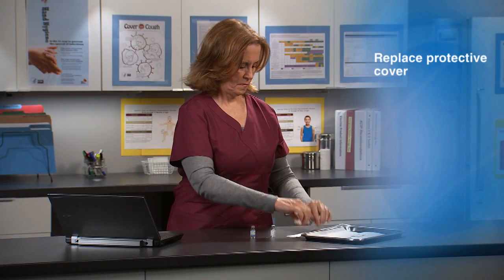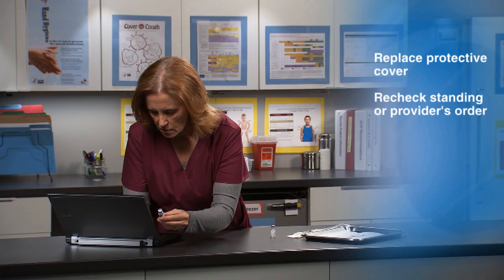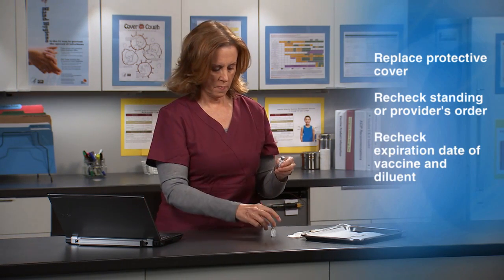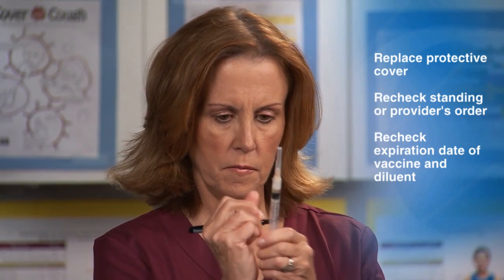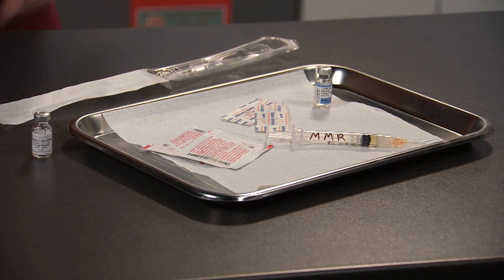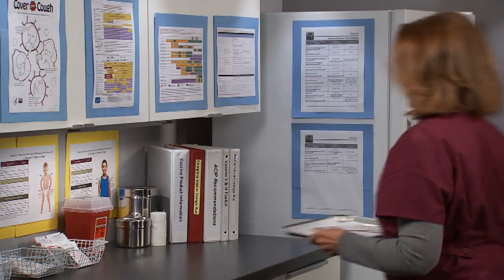Now carefully recap the needle by replacing the protective cover on the needle. Recheck what you have drawn up against the standing order or provider's order. Recheck the expiration date of the vaccine and diluent. Once in the syringe, many vaccines look alike. Label the syringe with the vaccine name or abbreviation. Appropriately dispose of the diluent vial. Retain the vaccine vial if necessary for documentation.